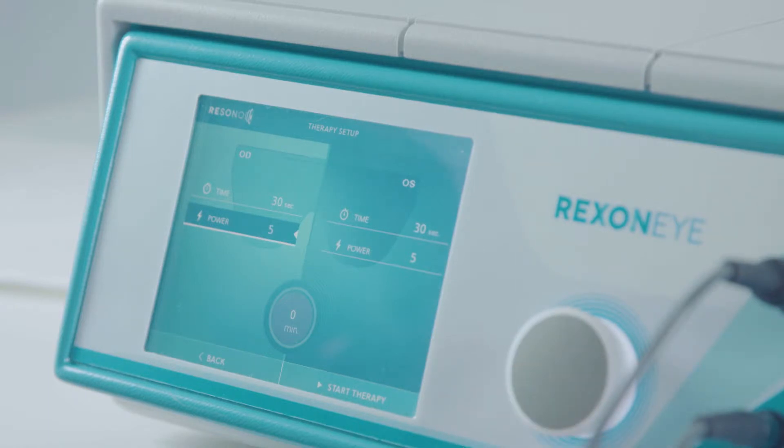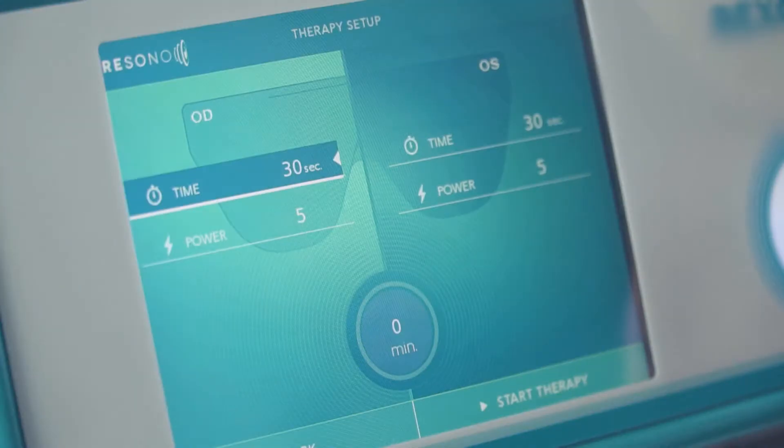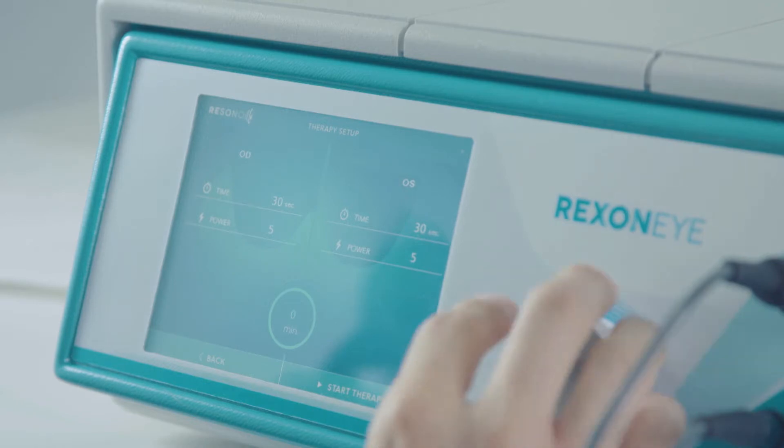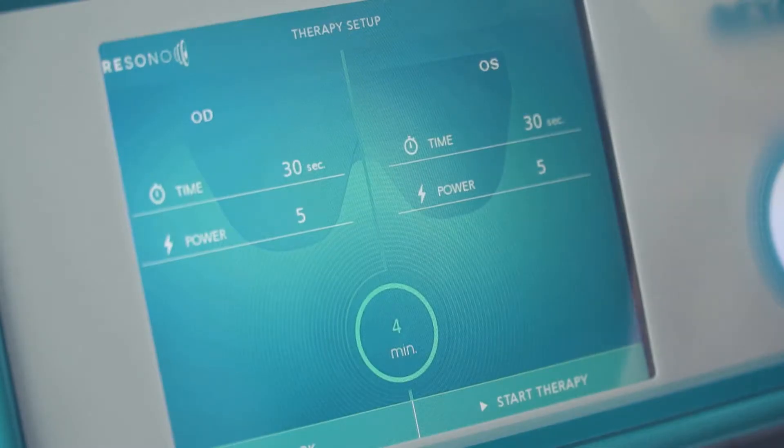About the power, the suggestion is to start at 5. Then increase or decrease the power according to the patient feedback. Set the parameters for the other eye. And finally, select the duration of the treatment. The suggested therapy protocol is about 20 minutes.